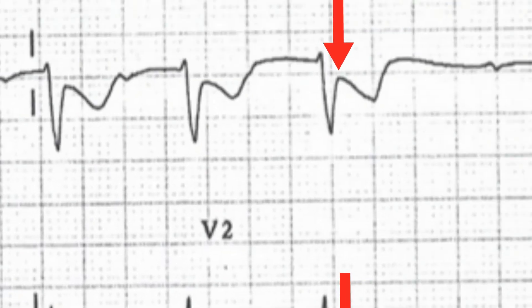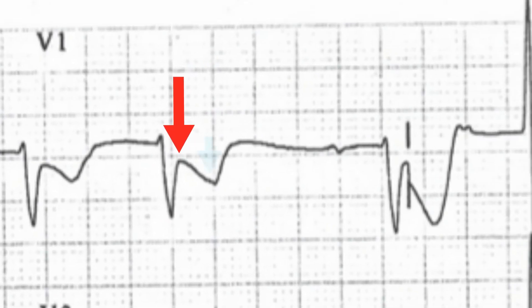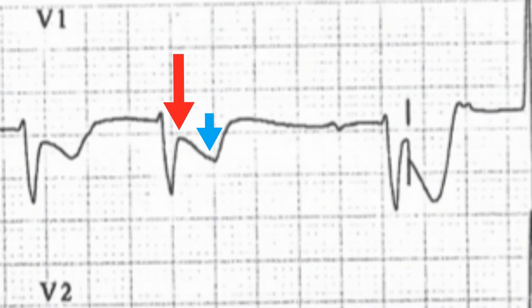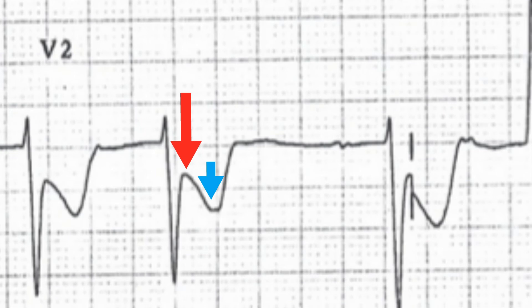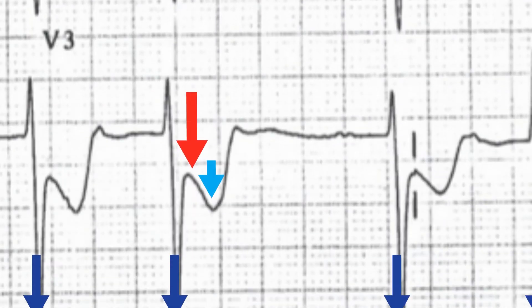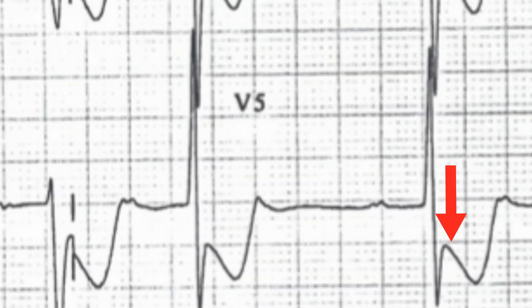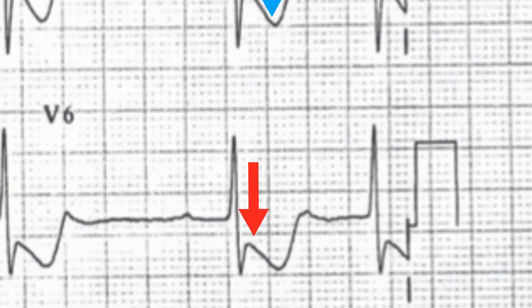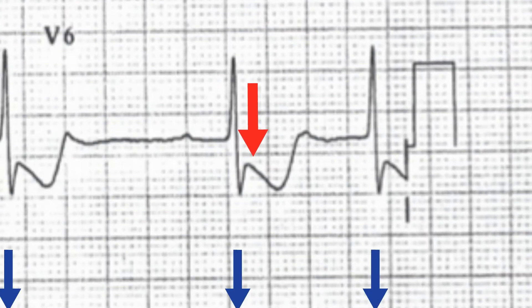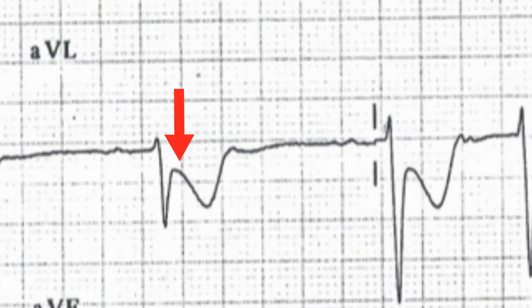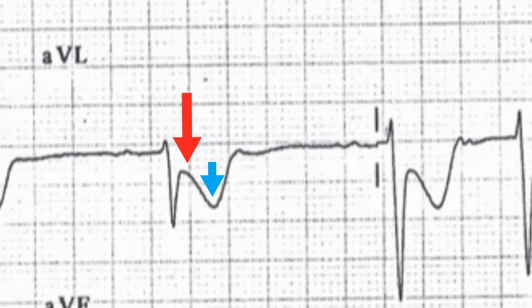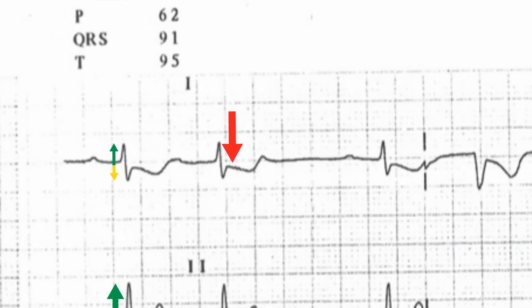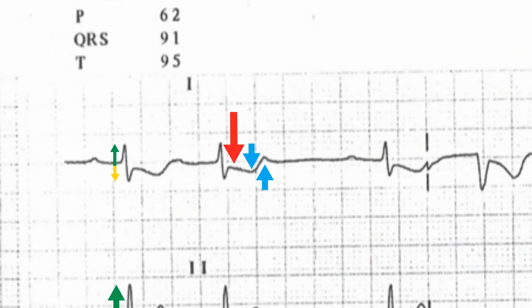There's T-wave inversion present in leads V1, V2, V3, V4, V5 and V6. There's also deep T-wave inversion in AVL and a biphasic T-wave in lead 1.